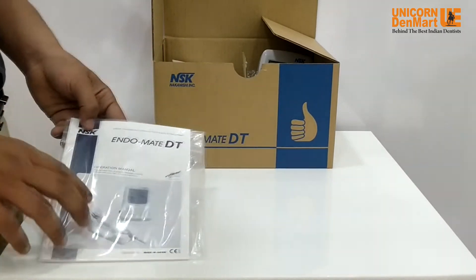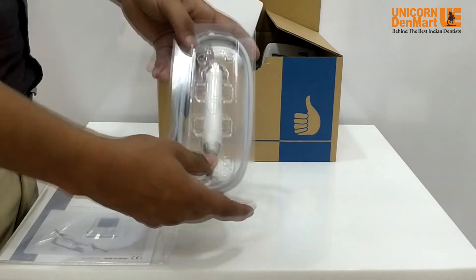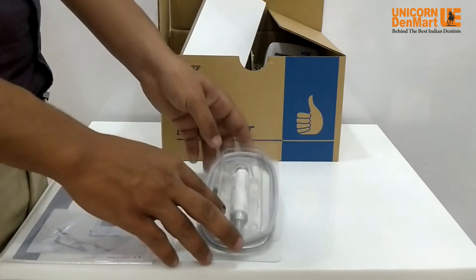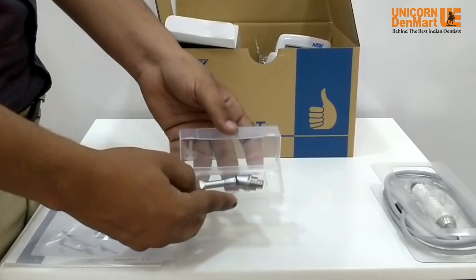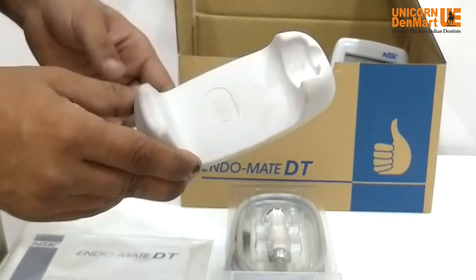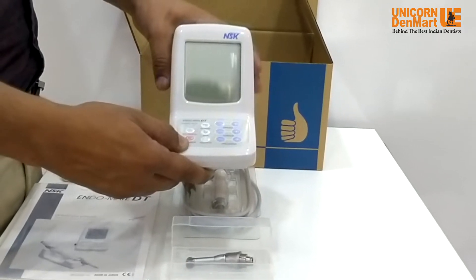Here is a detachable brushless motor with cord, having a speed range from 200 RPM to 13,000 RPM. This is a small transparent box with a gearhead with a 20:1 reduction ratio. This is a handpiece stand to place the handpiece in between operations.